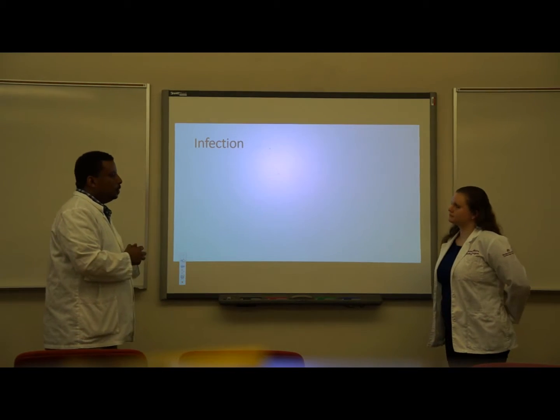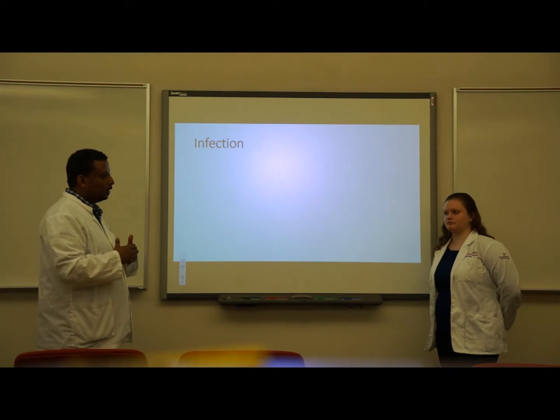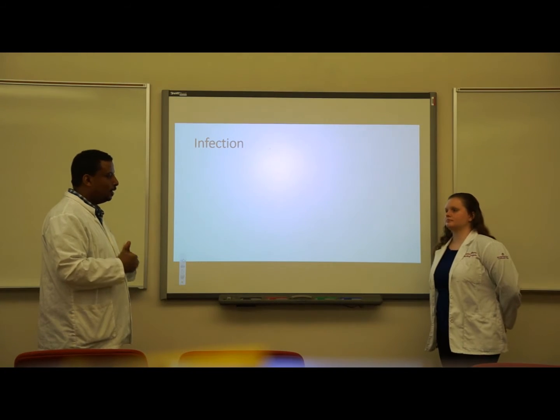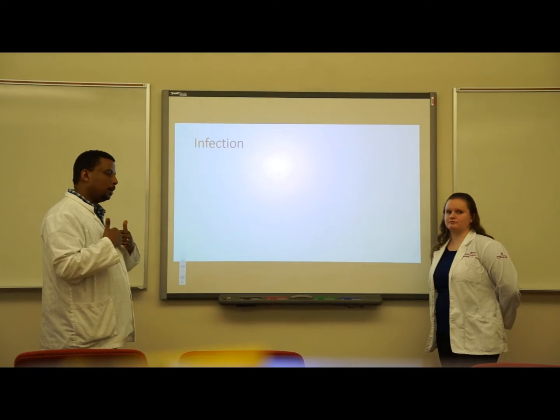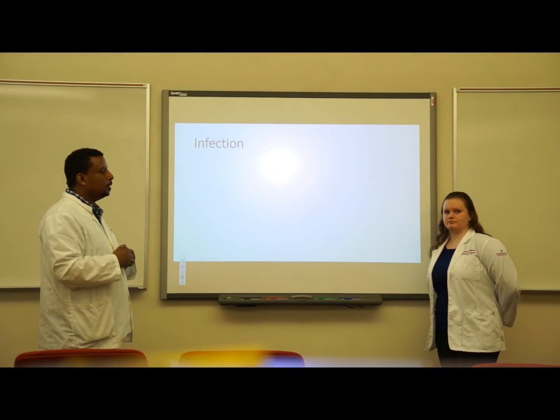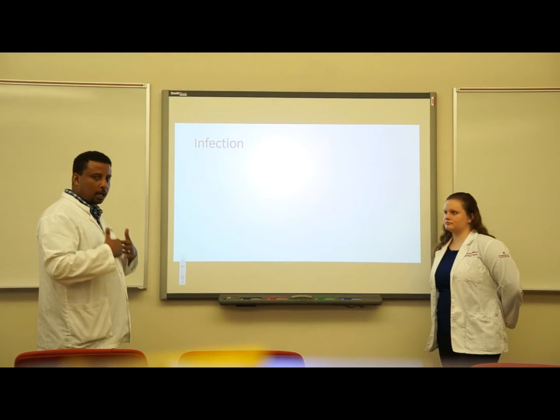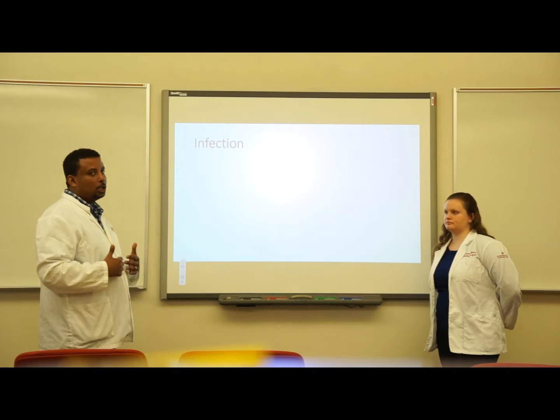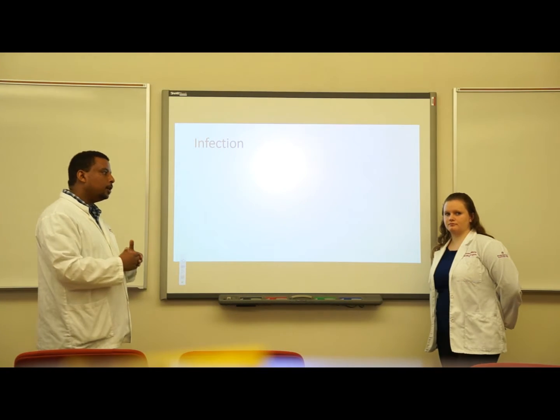The other problem is infection. So we talked about previously about driveline care. That is in the hospital sterile procedure. When they go home, we educate our patients to adhere to aseptic technique. As nurses, we always have to make sure that we change the dressing every day. And as we change our dressing, we have to monitor for signs and symptoms of infection.